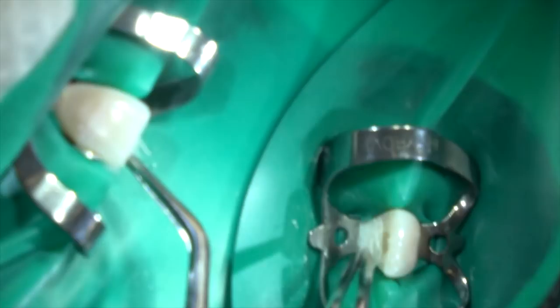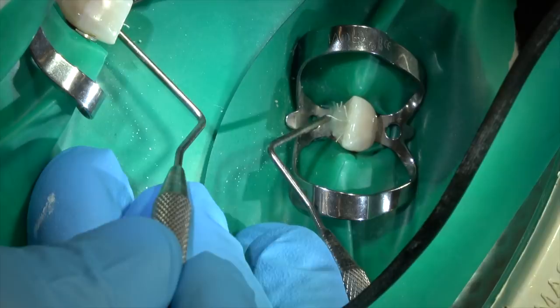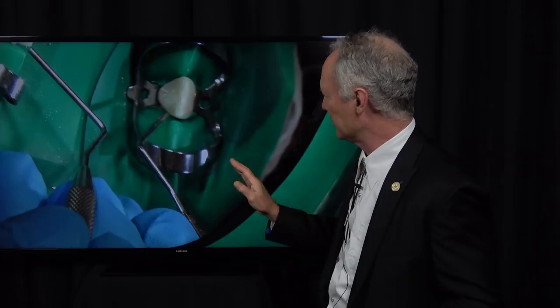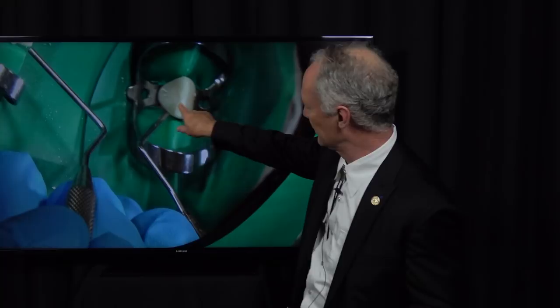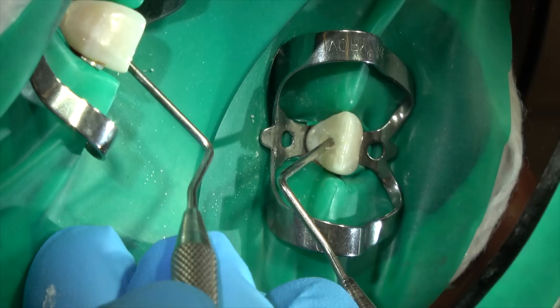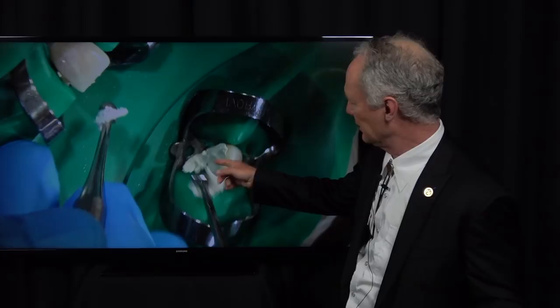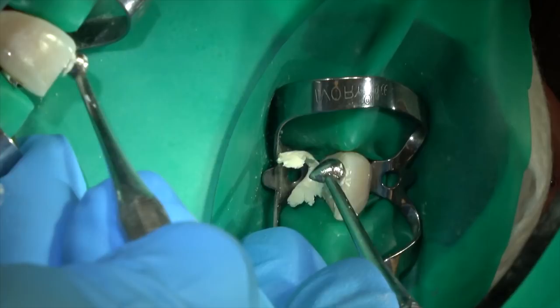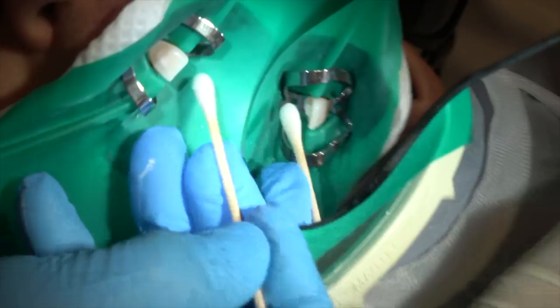Placing the cotton fibers over the entry — you want this to be a little bit into the opening. A hot tip: when you cut the opening, you want the inner part to be a little wider than the palatal part so there's a little undercut to hold your provisional restoration. The part on the palatal side should be a little thinner so you have an undercut. Pack the mixture in very gently. Then I'm placing IRM — just wet your finger and glove and put it in place. I'm using a little football instrument to shape the IRM, moving the margins side to side on a wet 2x2.